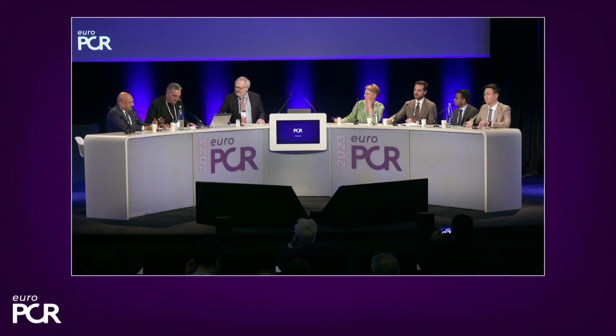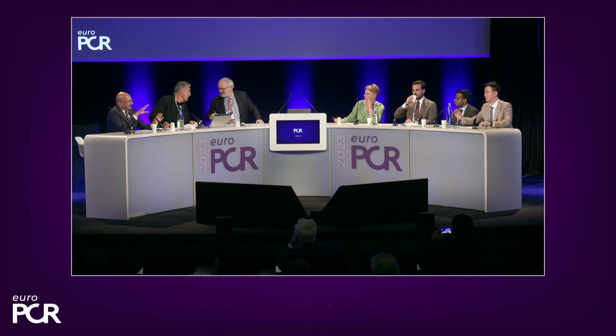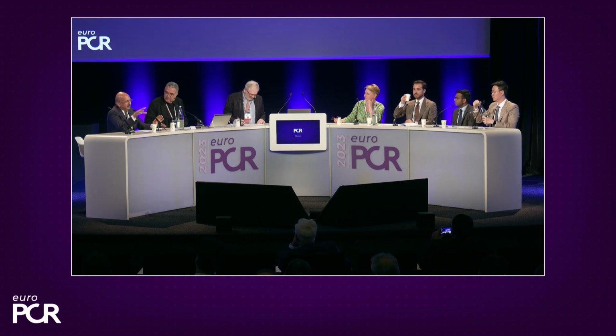Okay. So this is a very, very interesting situation where there is some difference between the CT angiographic image and the angiogram itself.